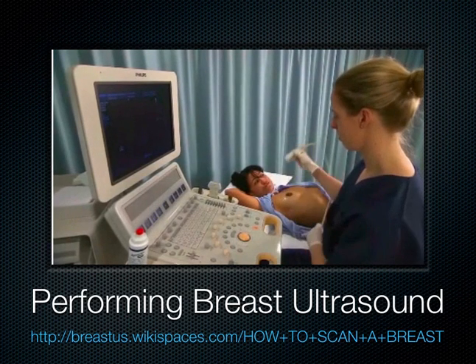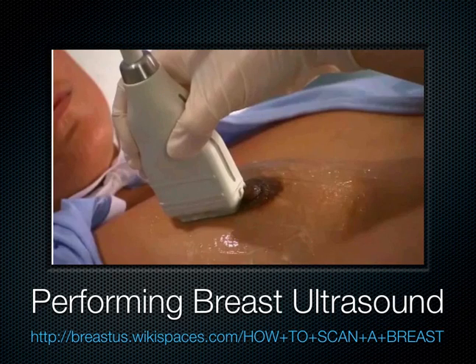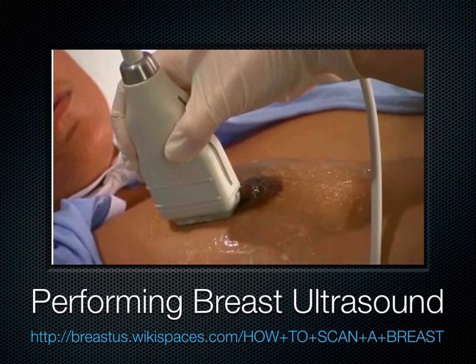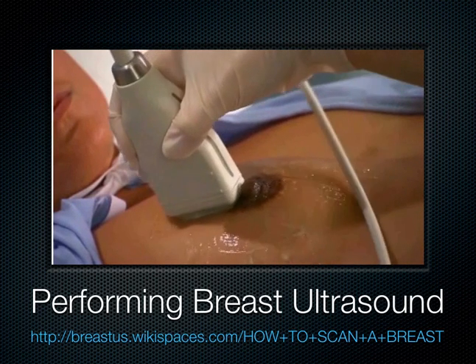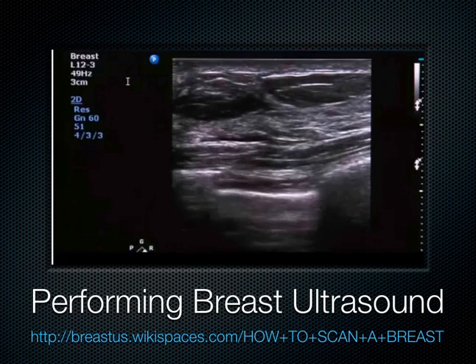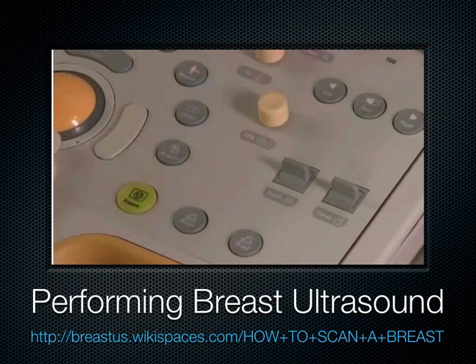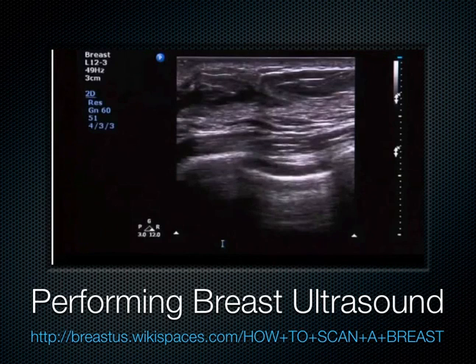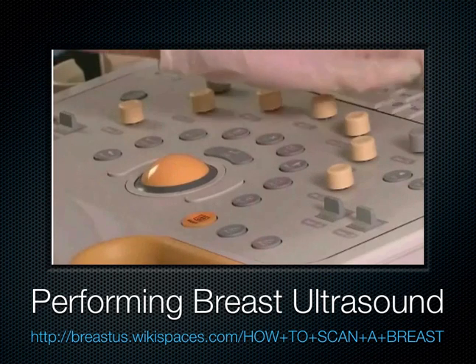To scan the breast with the clock method, place the transducer in the radial plane at the 12 o'clock position. Ensure that the notch of the transducer is facing the nipple. Manipulate the transducer until a suitable image of the breast is obtained. Freeze the image and then annotate the breast side, clock position, scan plane, zone, and structures.